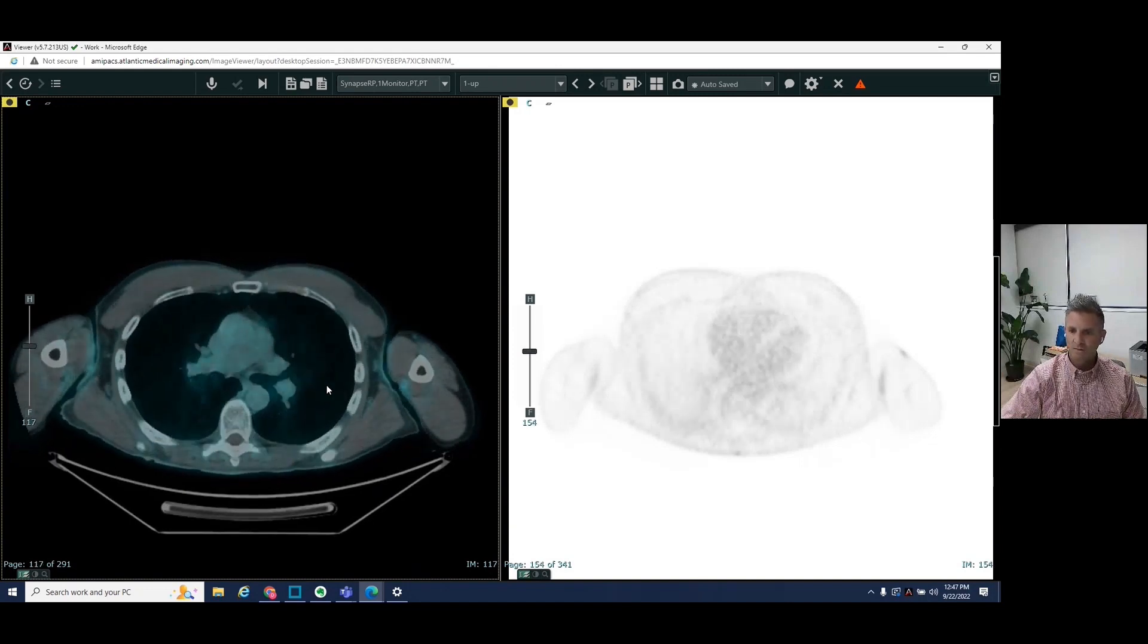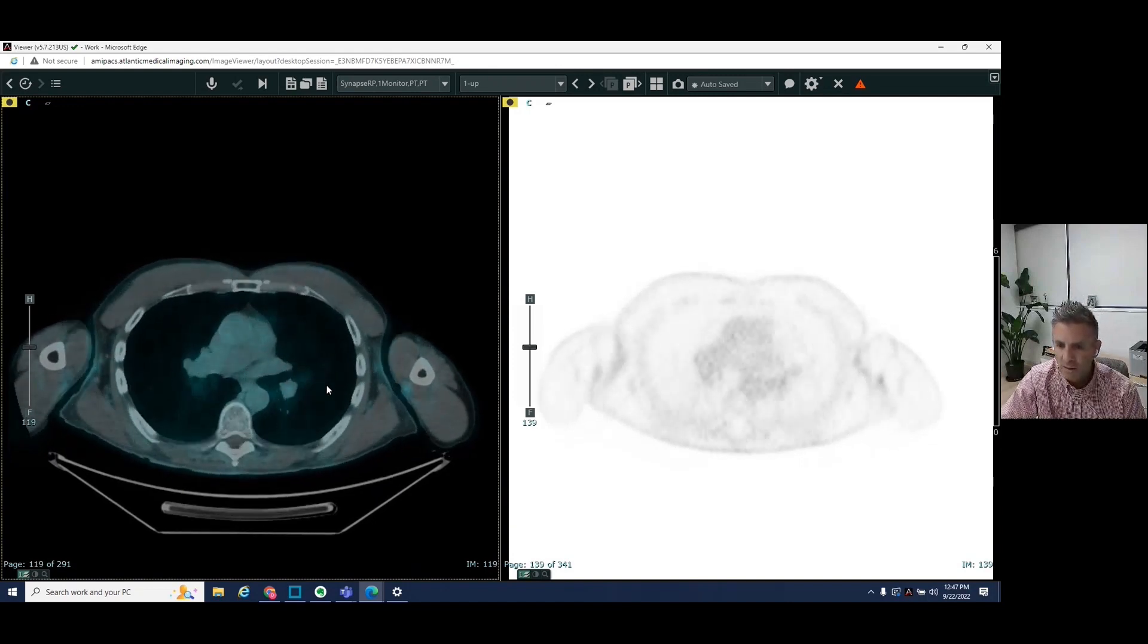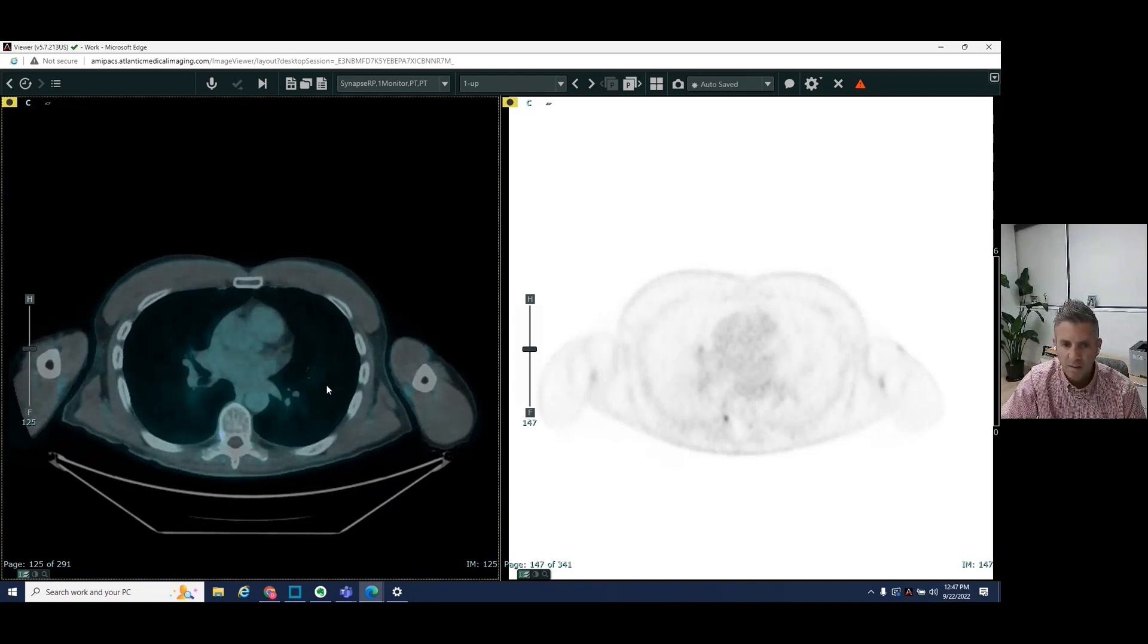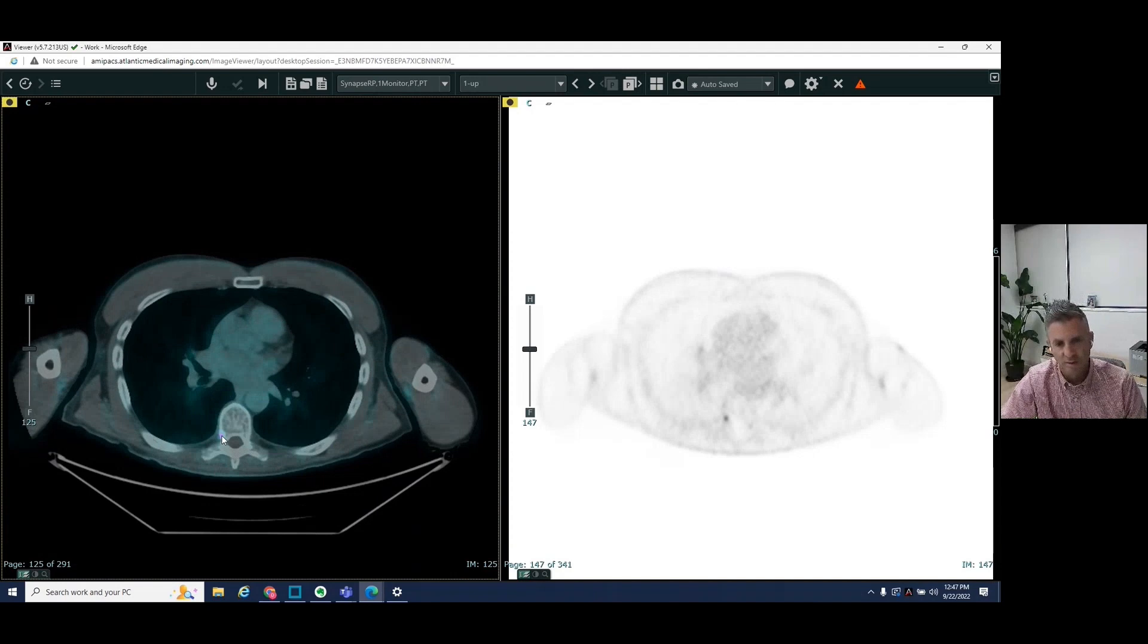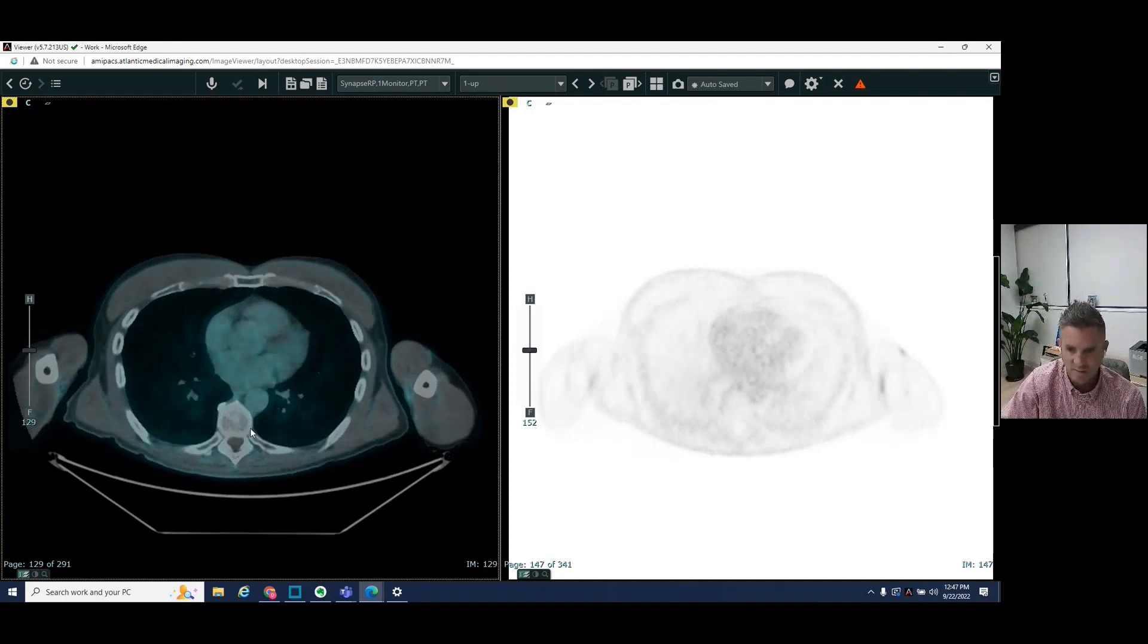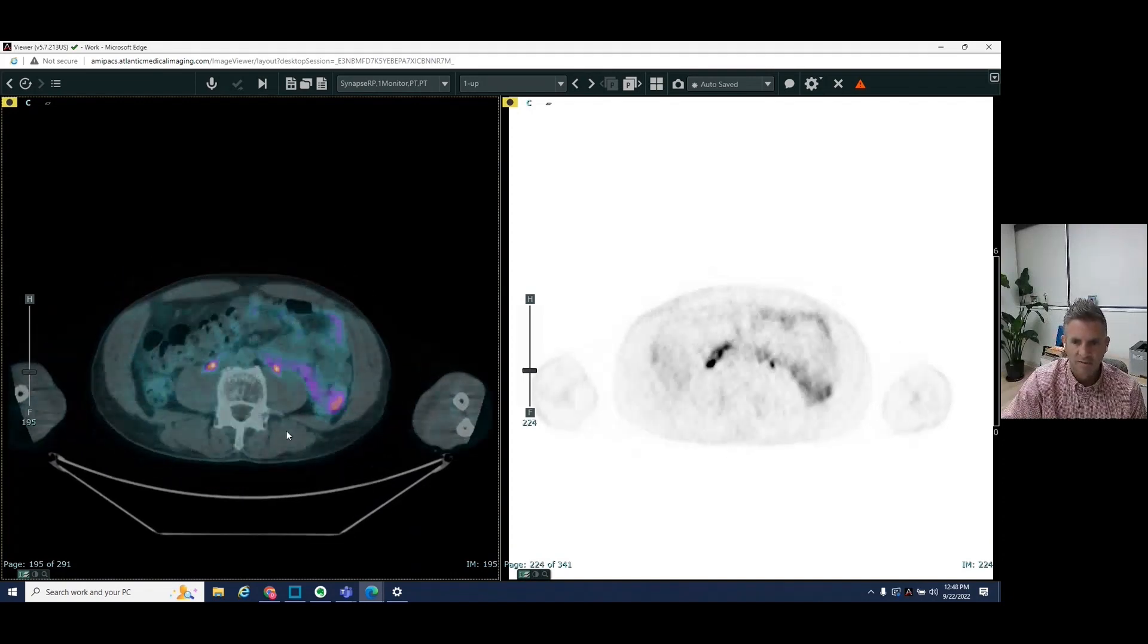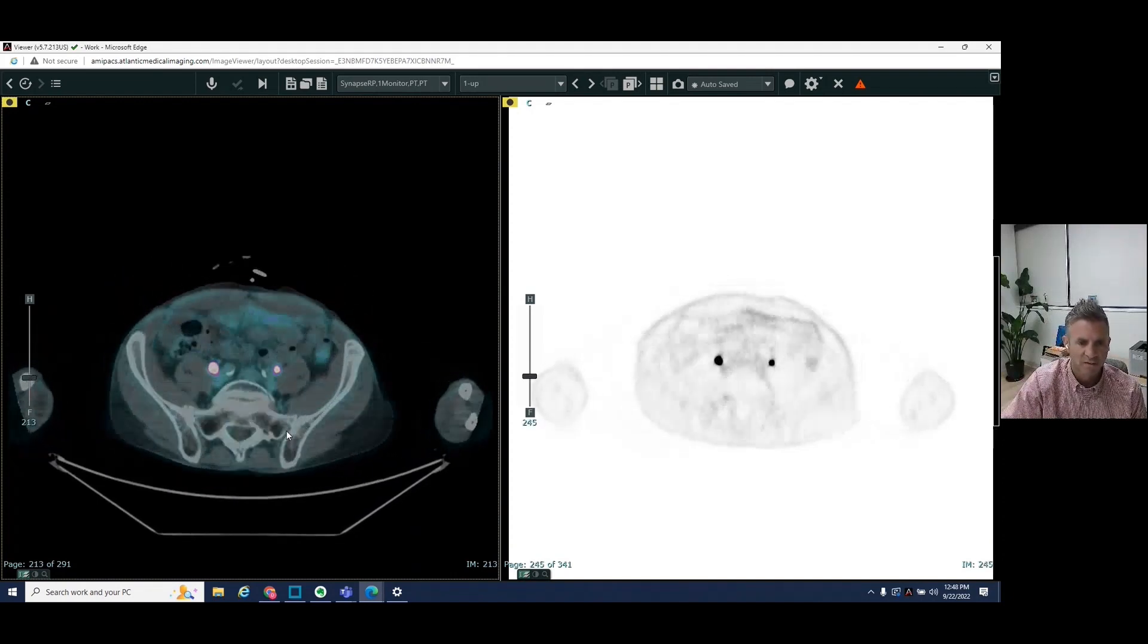Sorry. Go past. Sorry, right here. So in the right aspect of another thoracic vertebral body. So multiple areas in the chest and the spine. We get further down into the pelvis.